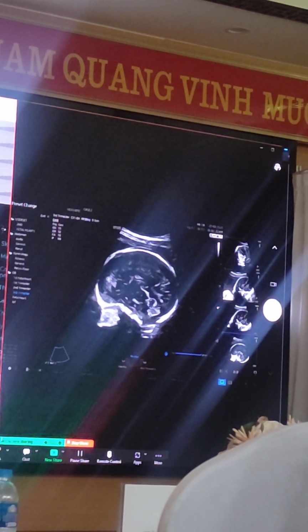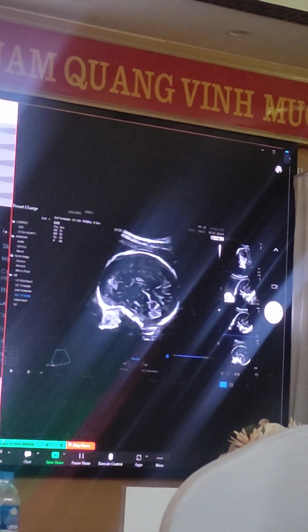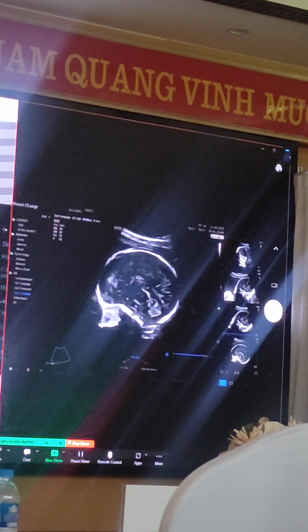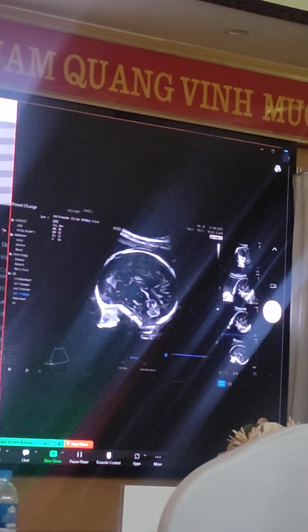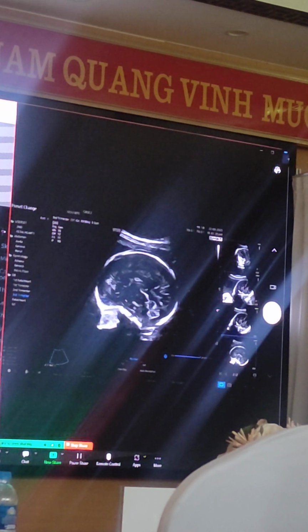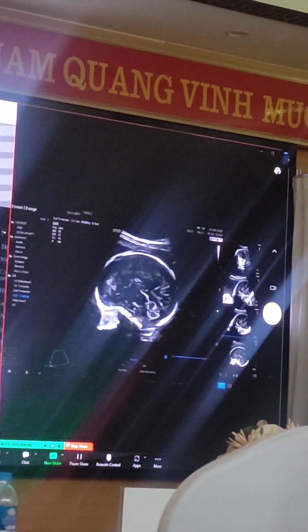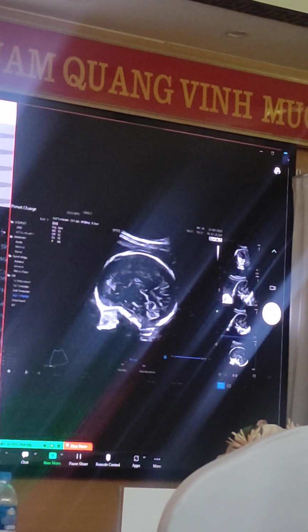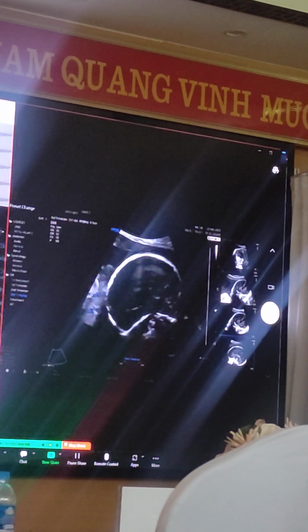You got here the brainstem that makes you able to both breathe and drink without choking. And then you go to the vermis, the cerebellar vermis. It looks complete and normal size. I never measure the vermis when it looks normal, because anyway, I don't really know how to do it. And then this is the fourth ventricle that has a normal shape and size as well. So this strictly sagittal plane looks pretty normal.